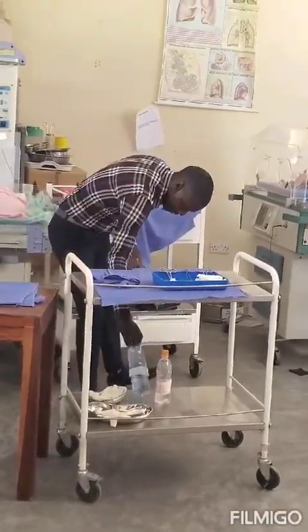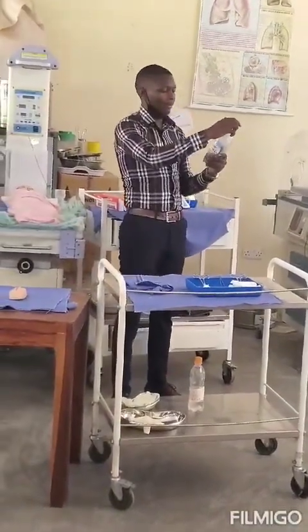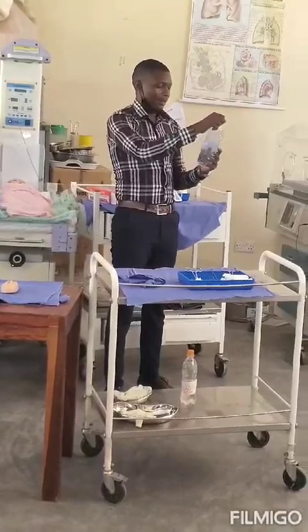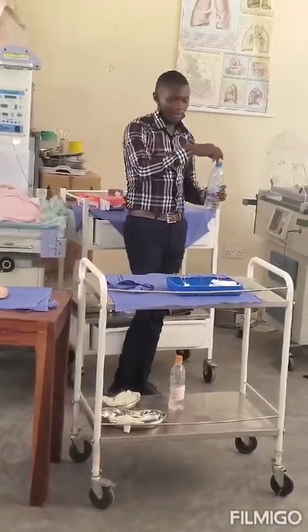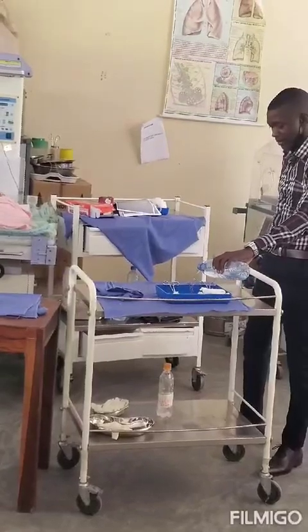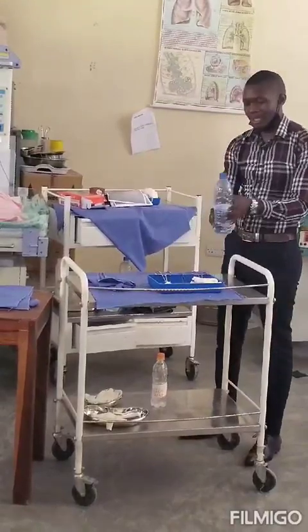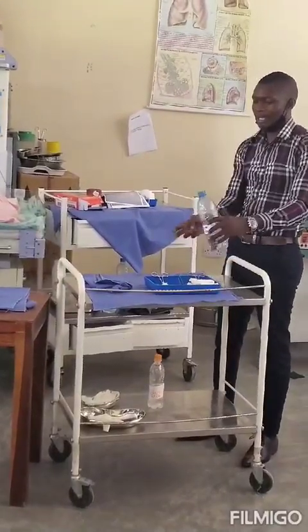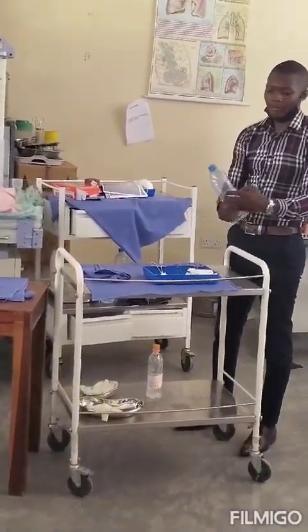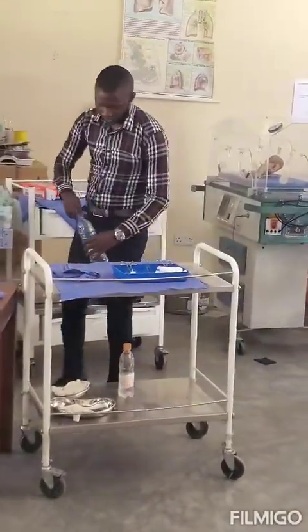So the only thing I will do is I'll get this normal saline expiring on 11 December 2024. It's potent for use, and you pour away from there. The label shouldn't face the field, but it should face away from the field like that.